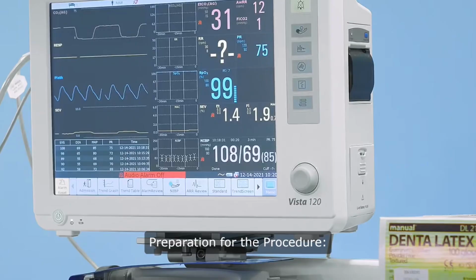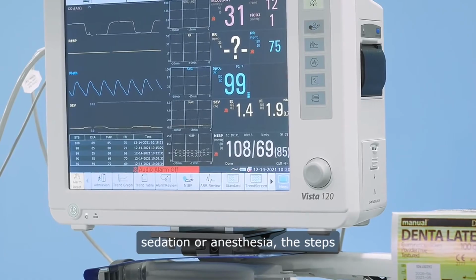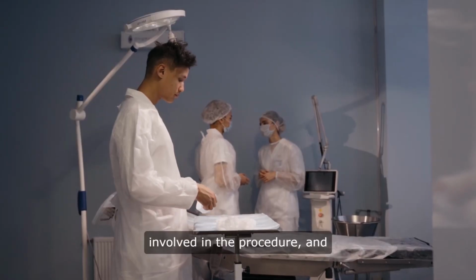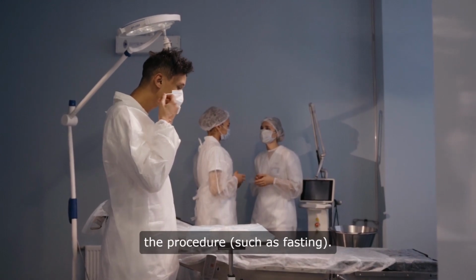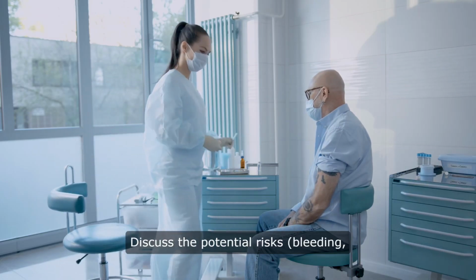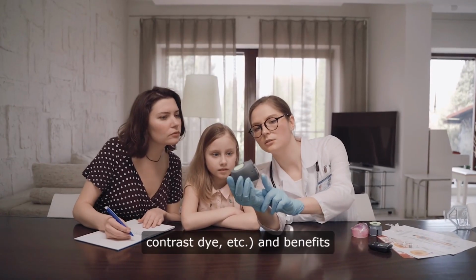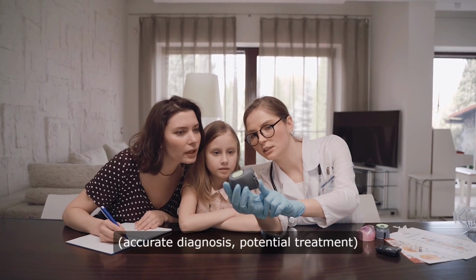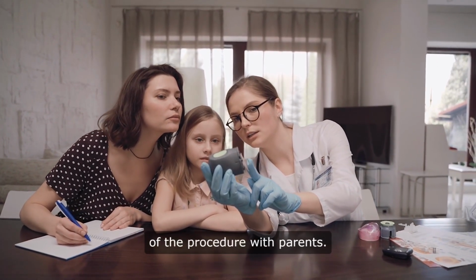Parent teaching. Preparation for the procedure. Explain to parents the need for sedation or anesthesia, the steps involved in the procedure, and any preparations required before the procedure, such as fasting. Understanding the risks and benefits. Discuss the potential risks, bleeding, infection, allergic reactions to contrast dye, etc., and benefits, accurate diagnosis and potential treatment, of the procedure with parents.